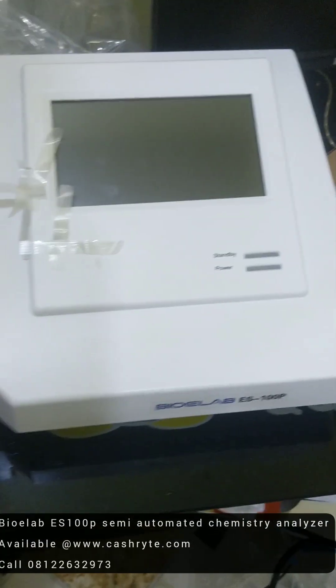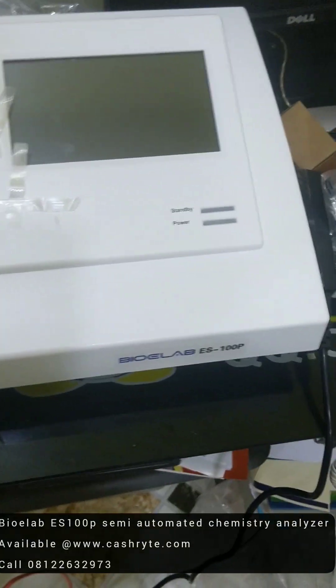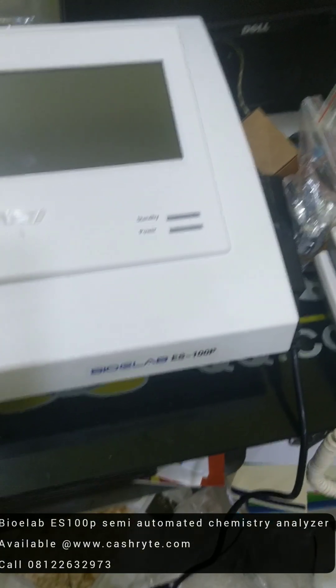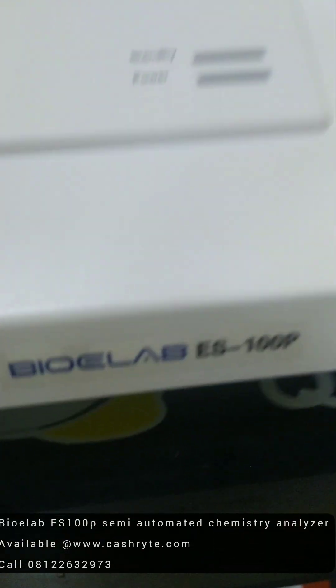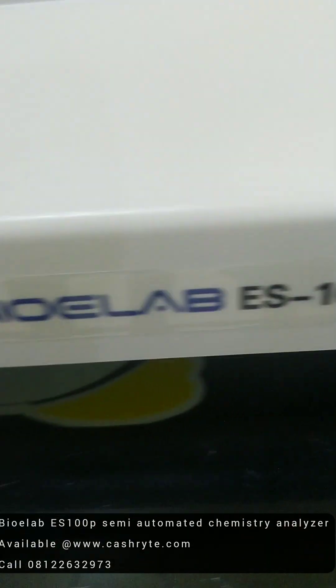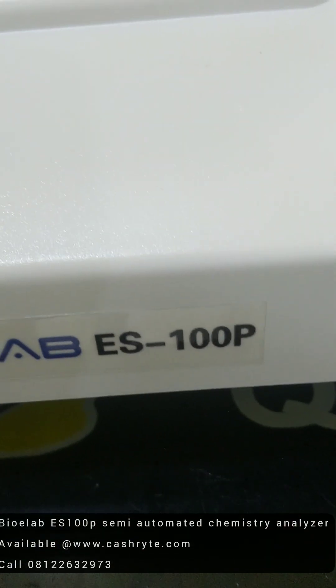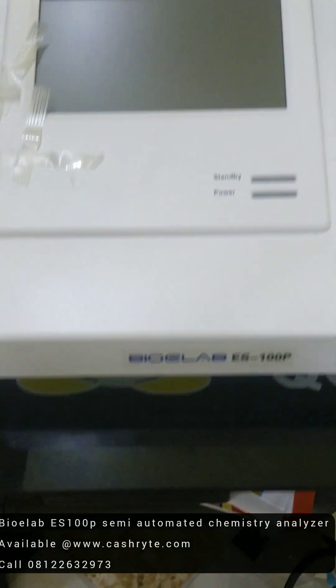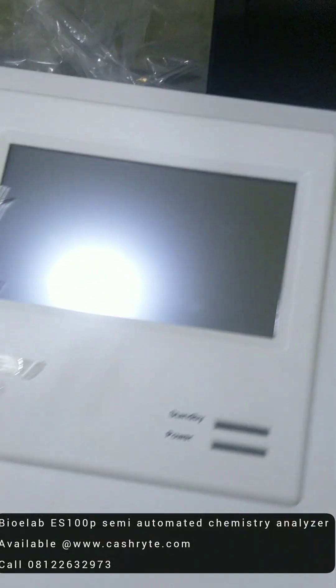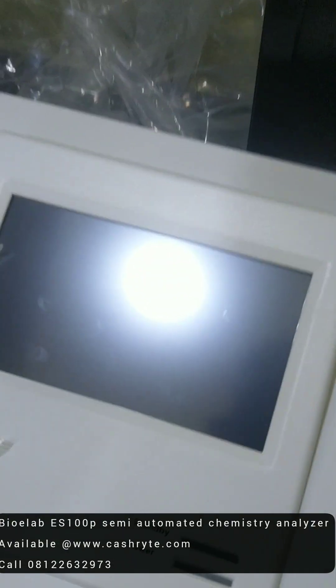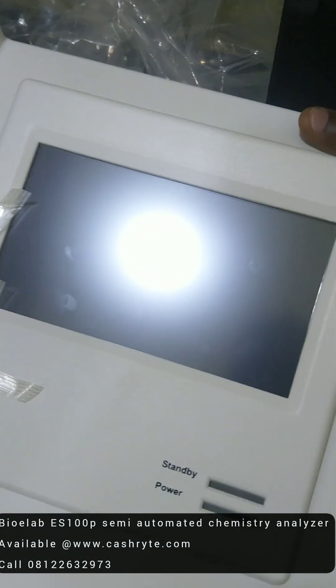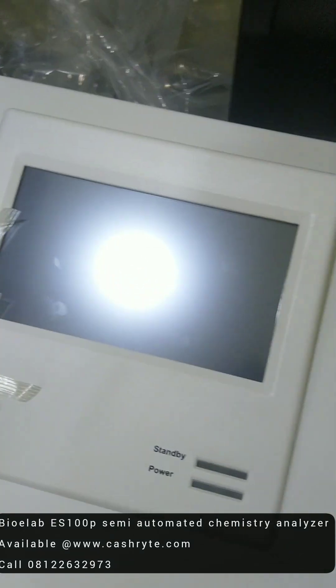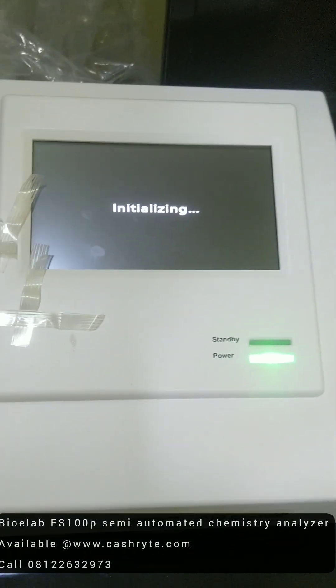Hi, good evening. My name is Ufuma. I'll be introducing you to our BioE-Lab Semi-Automated Chemical Analyzer ES100P. It's a fast selling and most reliable semi-automated analyzer you see in the market today.